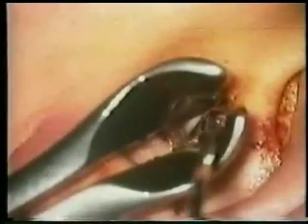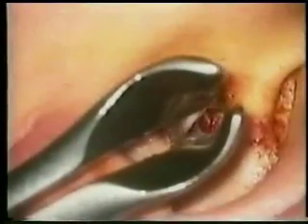This operation demonstrates the closure of an eardrum perforation by going through the ear canal to use an inlay technique to create the closure.